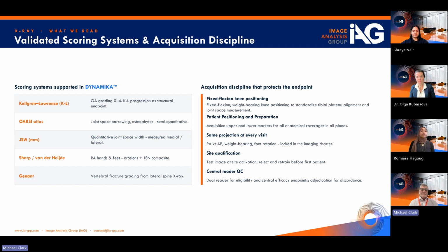Now, on the right side, we want to emphasize something that's just as important as it is to choose the methodology within your study. The data output is only as good as the images that you acquire and the quality of your data. And that's why it's super important to ensure that we're able to acquire high quality data throughout the course of the study. And we do this through several key practices.